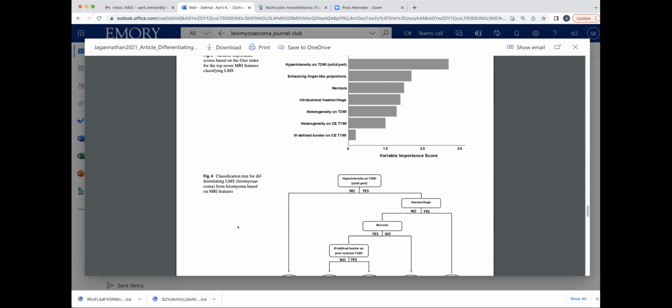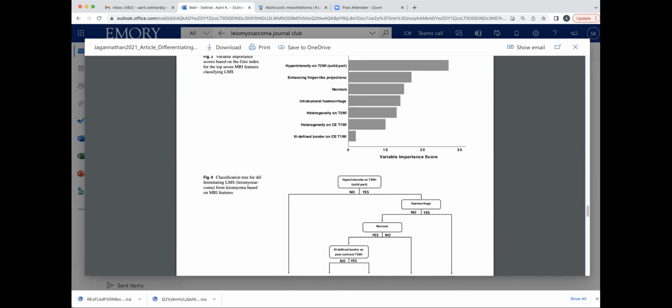However, given this concern, for example, large size, single in number, and then with that nodular contour and heterogeneous appearance, leiomyosarcoma cannot be excluded, just to keep ourselves on the safer side. So yeah, that's my thought process. That's good, excellent.